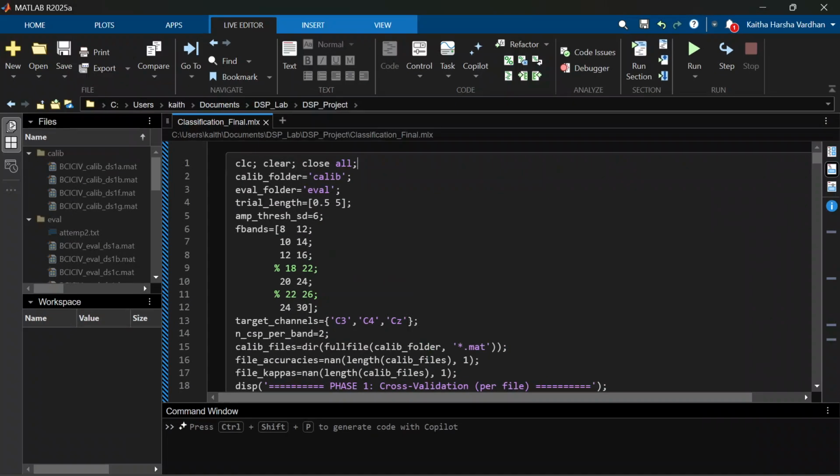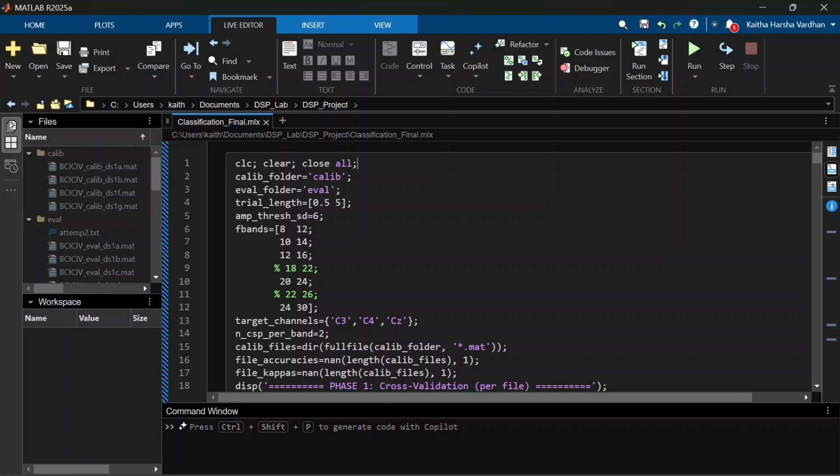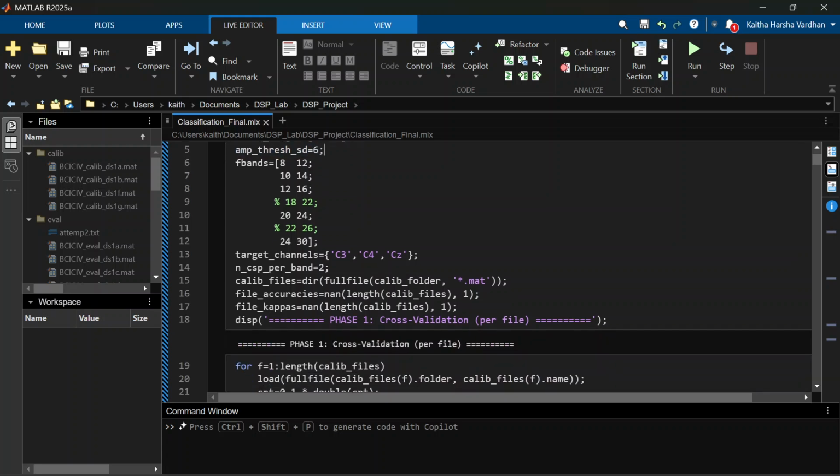I'll try to explain the MATLAB code. You just load the dataset which you downloaded from the website into your MATLAB folder, and then load the folder in your workspace. After that, I have created a trial length of 0.5 to 5 seconds. This is the epoching: we split the data into time windows of this duration. We have set the amplitude threshold for artifact removal, and these are the frequency bands. As I said, the 8 to 30 Hertz range will be divided into many frequency bands, and these are the target channels.